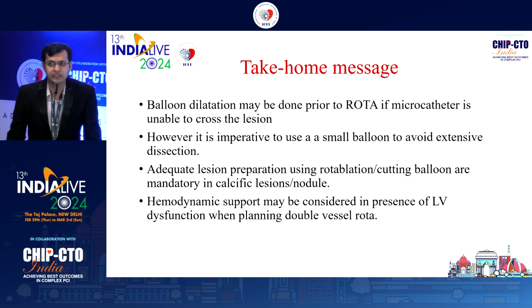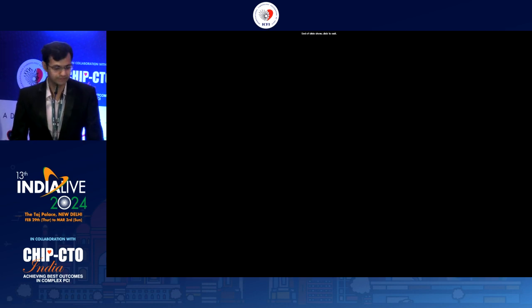In this case, I did not use a hemodynamic support device because the patient's LVEF was normal, although we did have backup facilities for an IABP if required in the lab. Thank you.